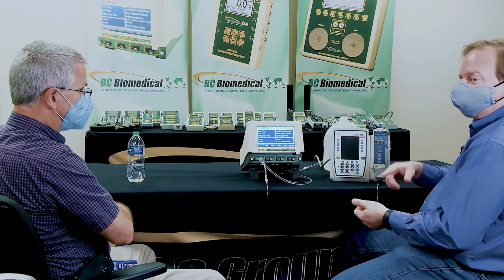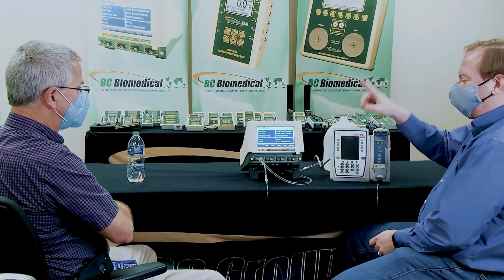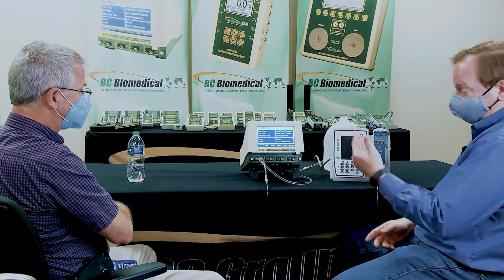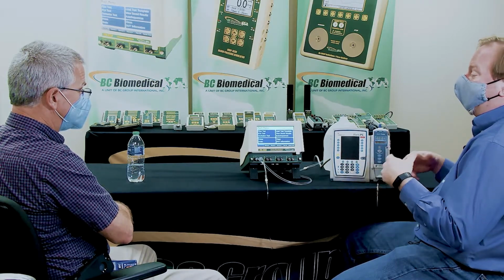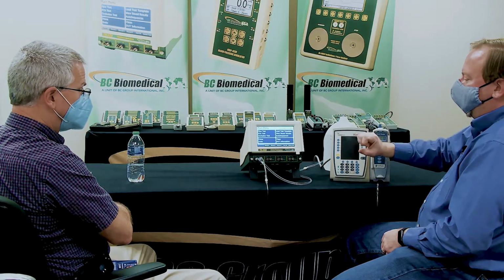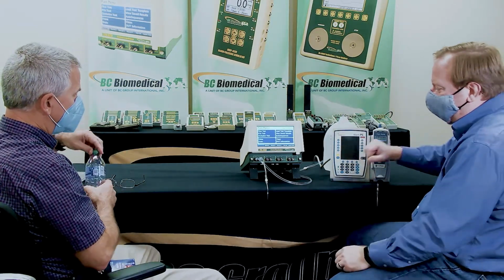Now you might say, well, what's PCA? That's patient-controlled analgesic. So they have the button, and it does the ejection. Need some more morphine. So that's going to be a pulse of fluid, and then a pause, and then another pulse, and a pause. We're still measuring flow, but it's a different algorithm and a different set of displays up on the screen. So we can measure how many doses were given, the time in between doses, the dose volume, and the dose flow rate. You don't need that for a flow test, so that's why it's separated.